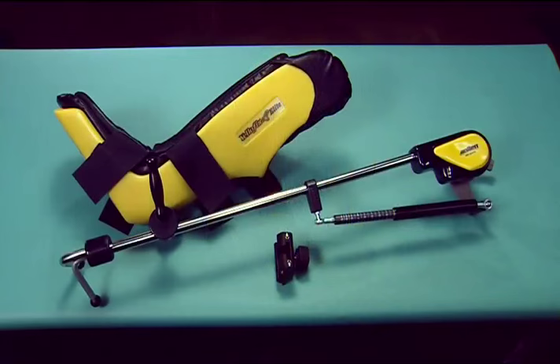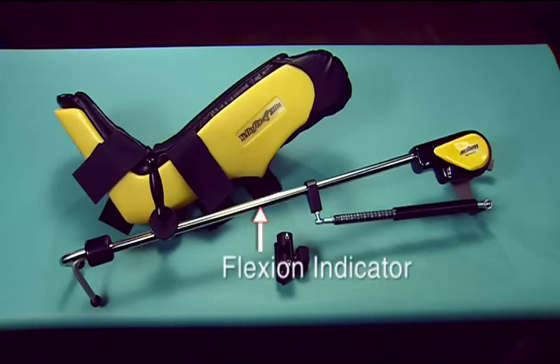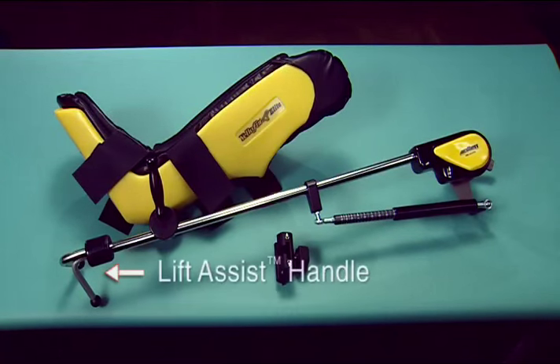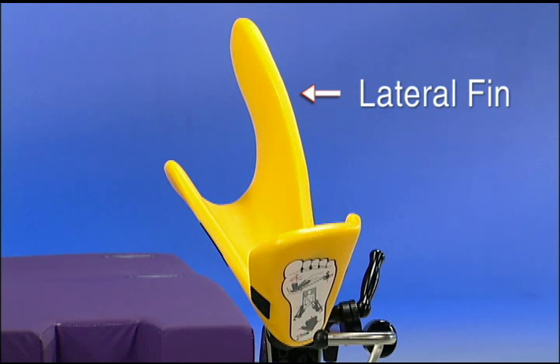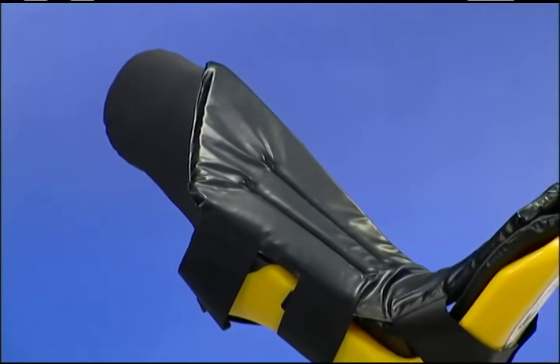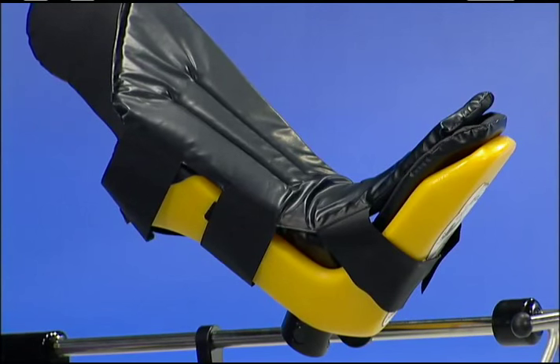We will review the multiple parts of the Yellowfin stirrups: the boot and fin, the clamshell boot pad, flexion indicator, lithotomy indicator, boot adjustment, and lift assist handle. The boot's lateral fin adds stability and ensures protection of the superficial peroneal nerve. The patient's knee should be aligned with the calf portion of the stirrup boot. Note that the stirrups should always be used with the pressure management boot pad. No extra padding is needed nor recommended with the Yellowfin or Ultrafin stirrups.